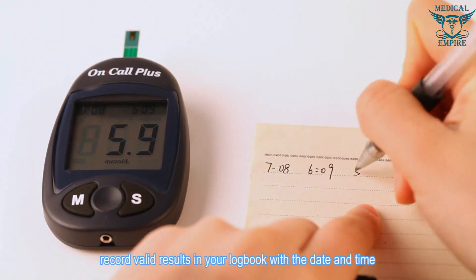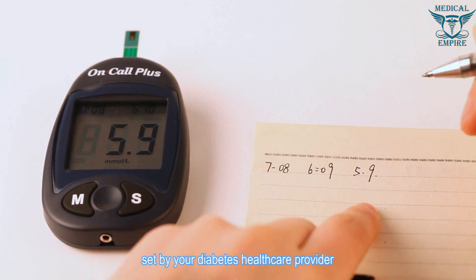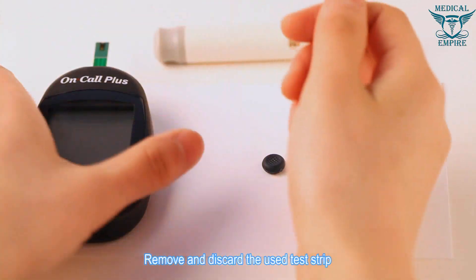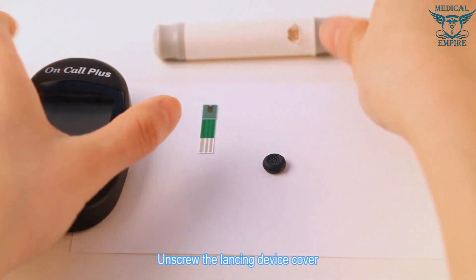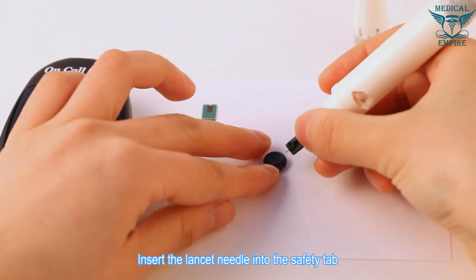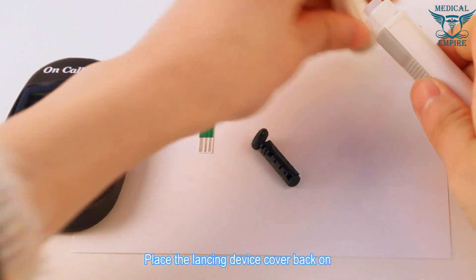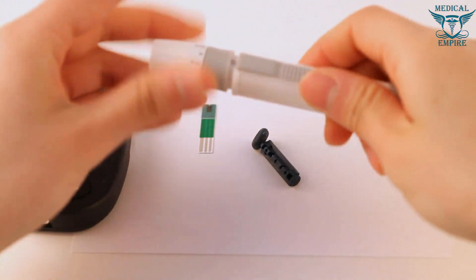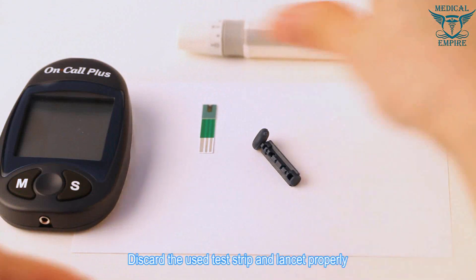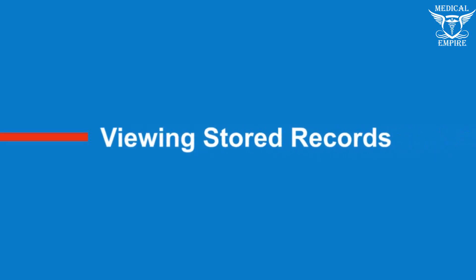After testing, record valid results in your logbook with the date and time and compare them to the target goals set by your diabetes health care provider. Remove and discard the used test strip. Unscrew the lancing device cover, insert the lancet needle into the safety tab, remove and discard the used lancet, and place the lancing device cover back on. Discard used materials properly, following all local rules when disposing of blood samples.